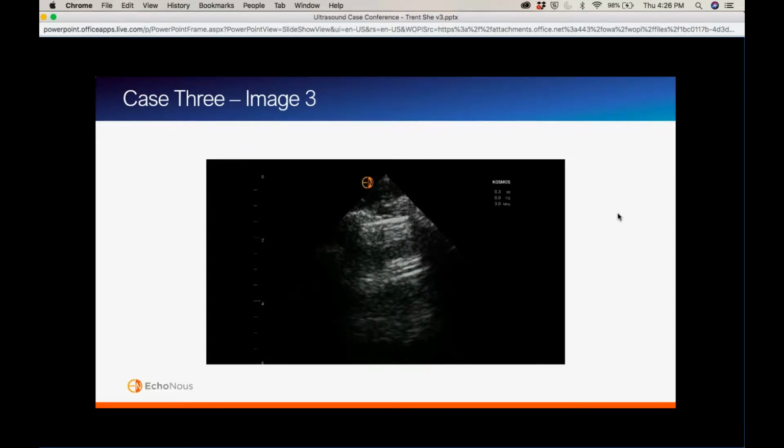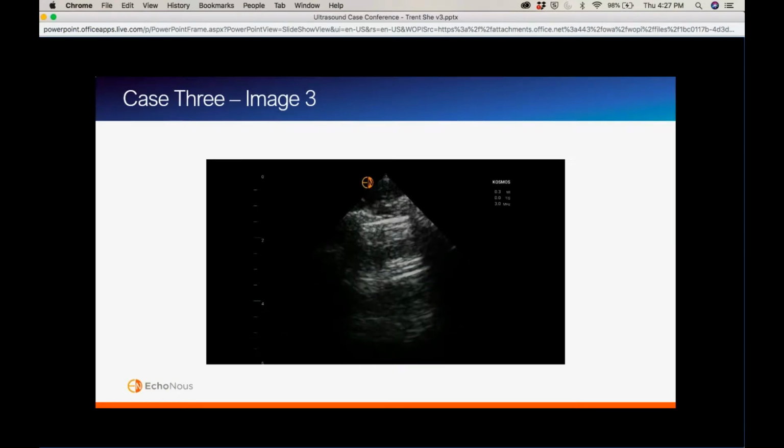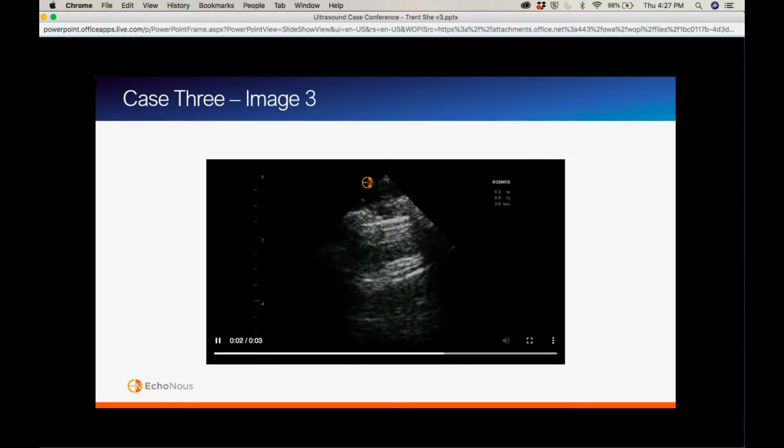It's so tough because we were thinking about it. With pneumothorax, sometimes your A lines can become a little bit more prominent as well, and these A lines here are pretty prominent. I bet I would have needled him. I think I would have, but I would have been wrong, right? I wouldn't have treated the underlying diagnosis. This guy would have ended up needing magnesium, albuterol, epi, and those sorts of things, I assume. So it would have been the wrong treatment, but I don't actually think it would have been the wrong intervention, because most people would have gone down this track, and it's not unreasonable.